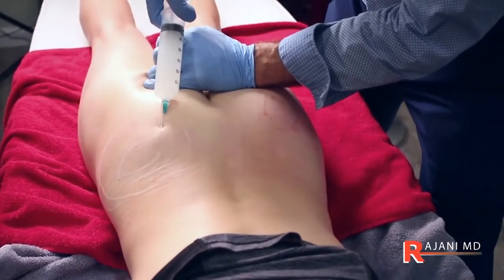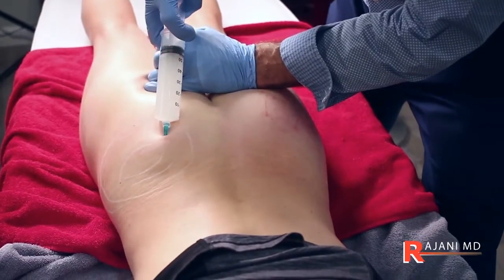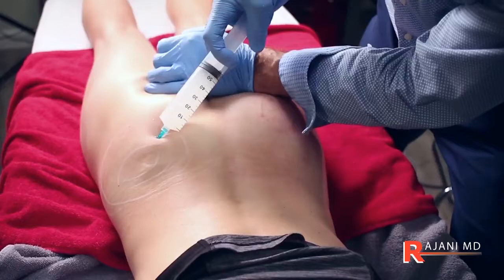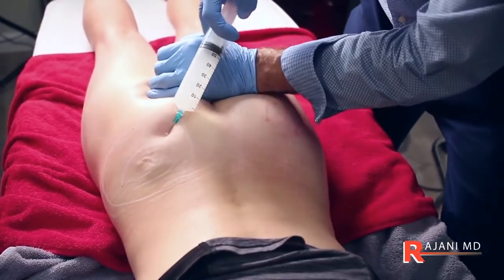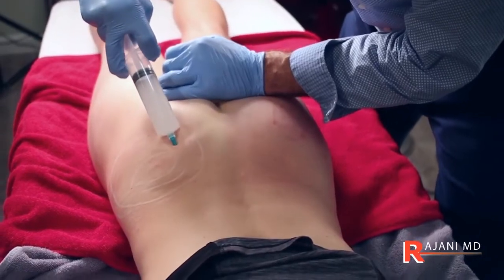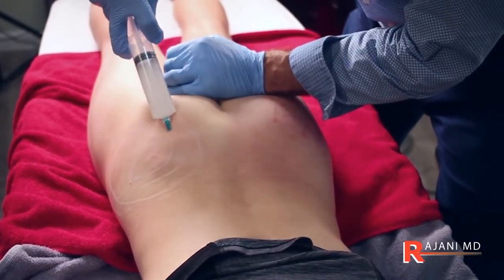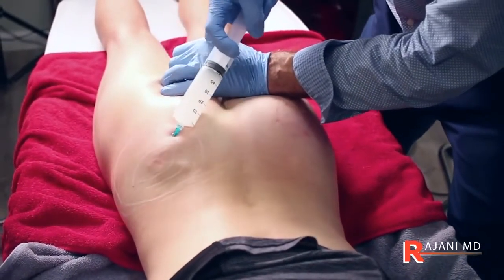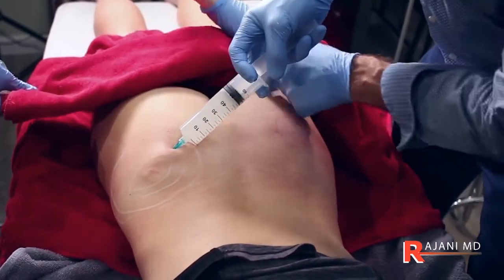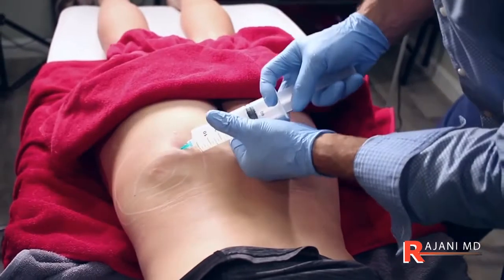What we're doing is coming in and putting Sculptra into the high buttock to get volume, to get lift, and you can treat cellulite prior to this to help smooth the skin. And it's all about vials. The more you do, the more volume you get. So we'll cover the patient on below here, and then I'll show you what I'm doing.